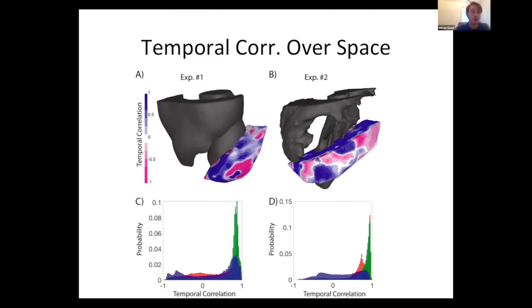assume. So we're looking at what we call the ground truth for ischemic stress development, this ST40 value, but we're also watching something that's very much the result of ischemic stress, this propagation-based change, and they're not occurring in the same space, right? So this gives you a pretty complicated picture, essentially meaning that this ischemia is pretty global across the whole beat, and it has pretty far-reaching consequences when it comes to various regions of the electrograms.